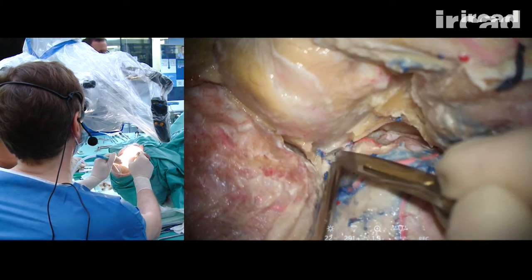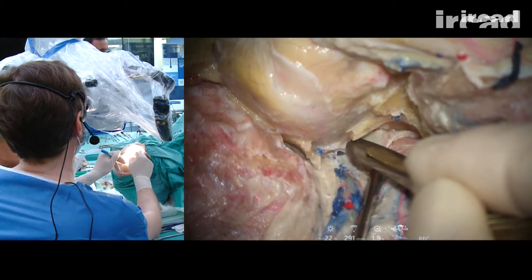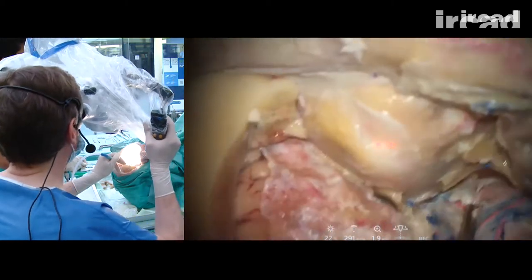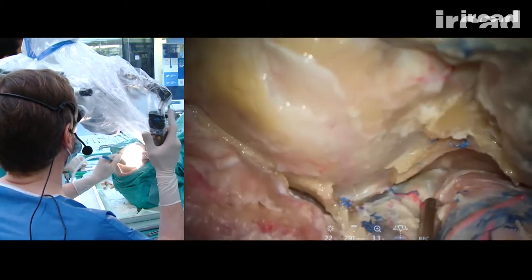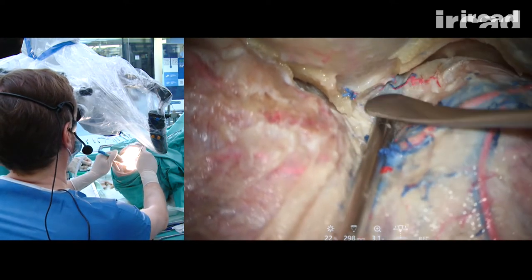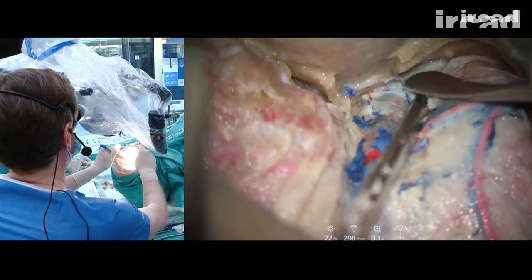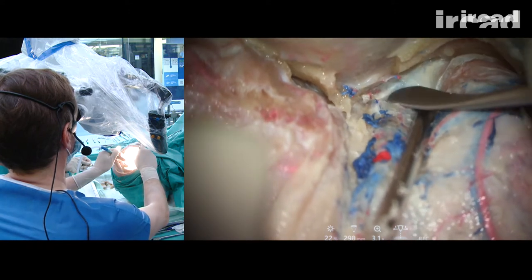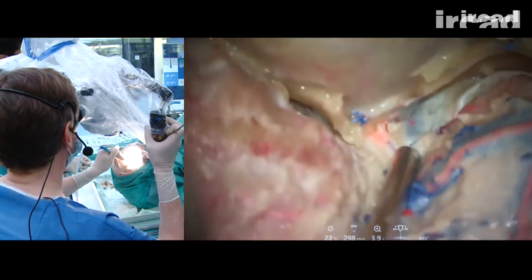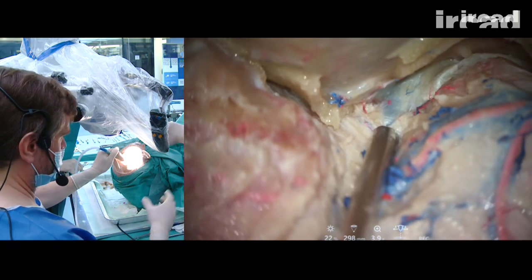So I just make an incision of the lateral aspect of the superior orbital fissure. Nothing crosses this part of the superior orbital fissure except the orbitomeningeal artery. And then I can peel progressively the dura mater from the most anterior aspect of the cavernous sinus, and expose it.